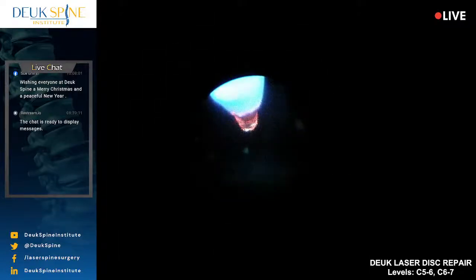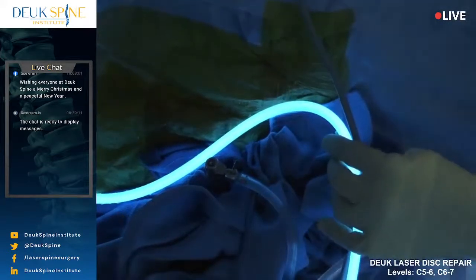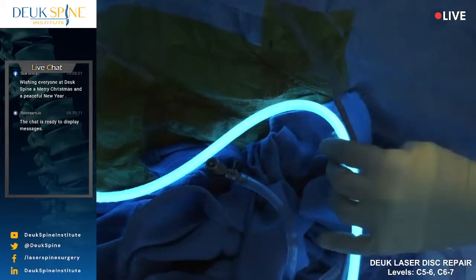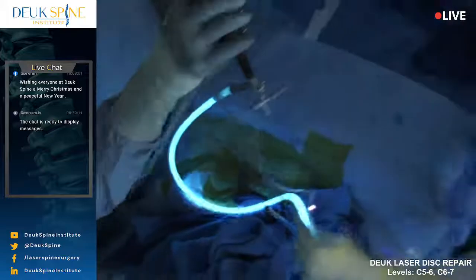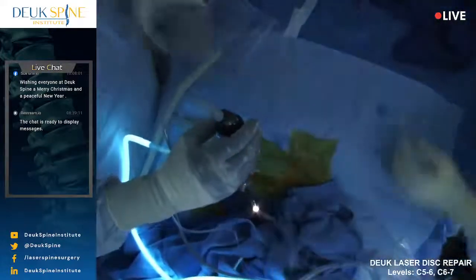All right, so there's a chunk of herniation down there that I just freed up with the laser. I'm going to go grab it and give it to Luis. We'll send these chunks of herniation off to the pathologist so they can look at it and verify that it's just degenerative disc and not anything else more serious.